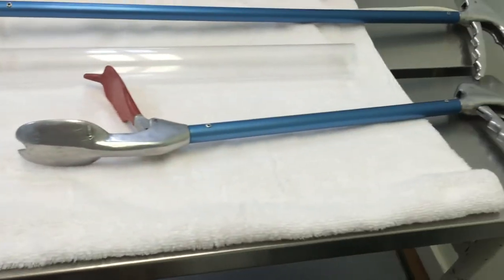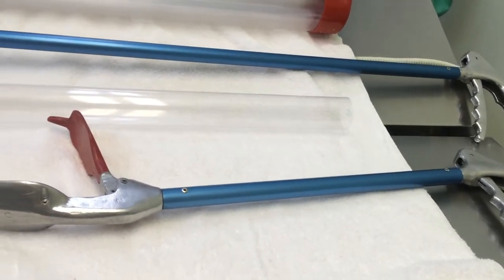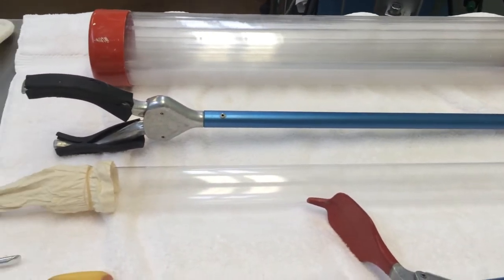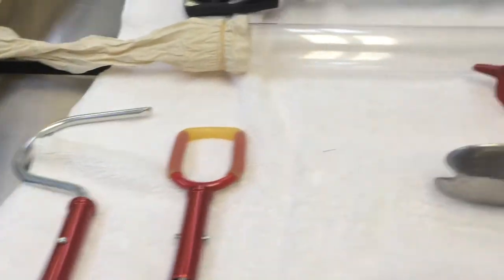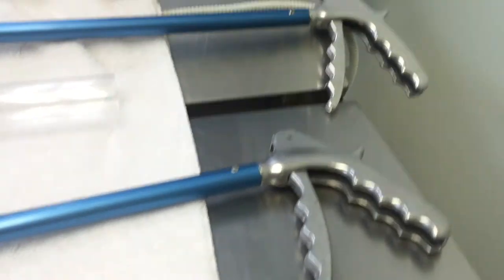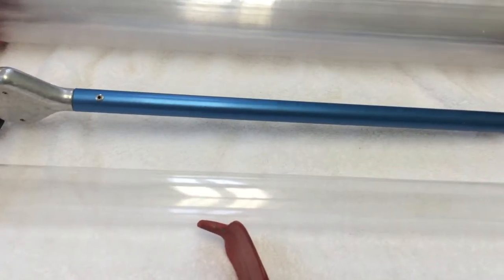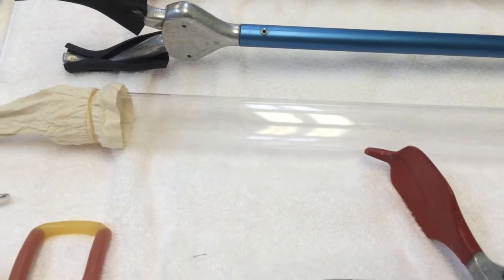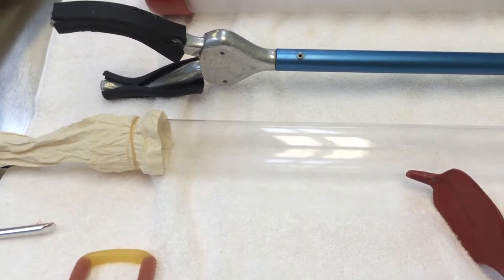I really love working with these things, so I more or less volunteer to do as much poisonous snake work as I can. I do have a few cobras as patients and some other poisonous animals. Whenever I get a chance to work with rattlesnakes or cobras, this is the equipment that I use. This is the basics. Other than that, we use gas anesthetics, digital x-ray. So that's 3 minutes of my little reptile kit workup.